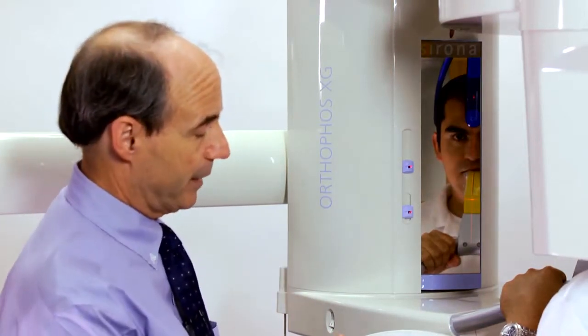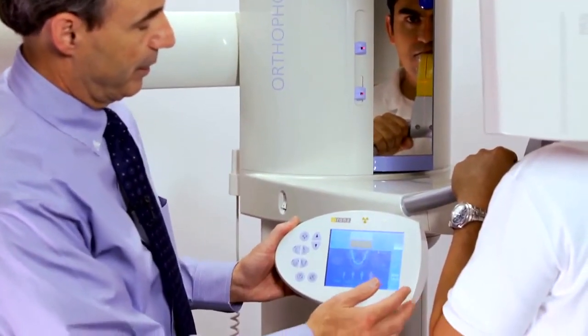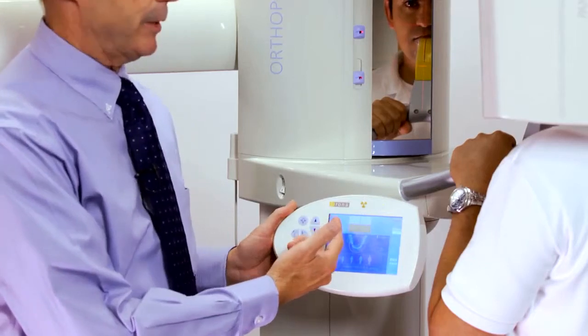For collimated volumes — that is, those where the volume would be smaller than 8x8cm — you can control this through the pad by pressing this feature. Seen in yellow is the area that is going to be collimated.